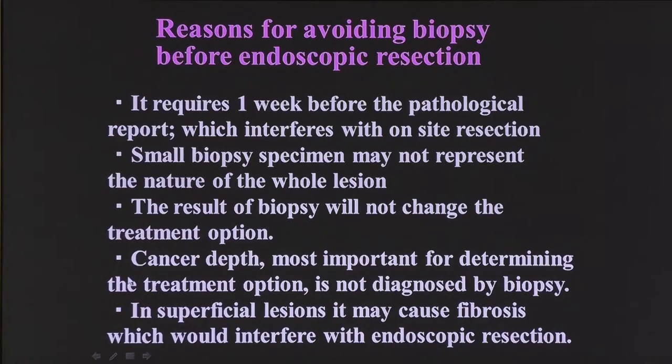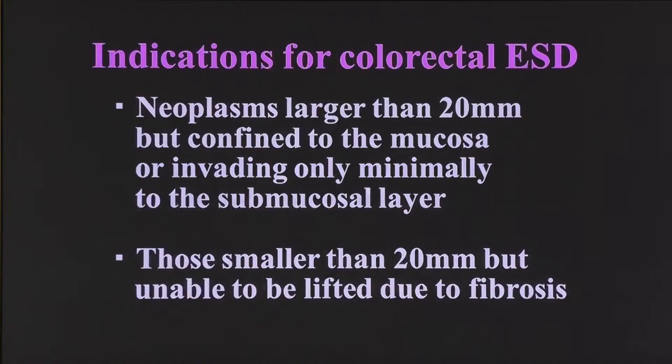And as I said, it is most important that in superficial lesions, a biopsy may cause fibrosis, which would interfere with endoscopic resection. So, to summarize the indications for ESD briefly, number one is neoplasms larger than 20 millimeters in diameter, but confined to the mucosa or invading only minimally into the submucosal layer.